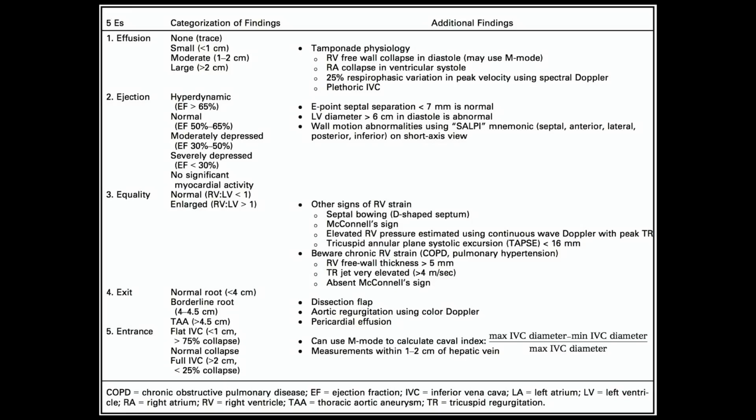And then what does the IVC look like? We didn't look a lot at the IVC, but we looked at it a little with that tamponade case. Is it large? Does it move with respirations, or collapse with respirations, or is it flat, right? If it's flat, we need some preload. If it's large, you have the preload. Now you need to utilize that preload and figure out what else is causing the patient's sudden demise.